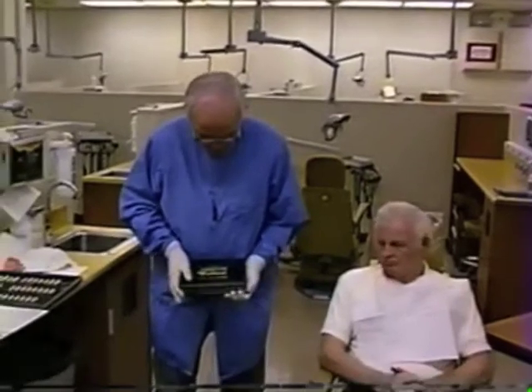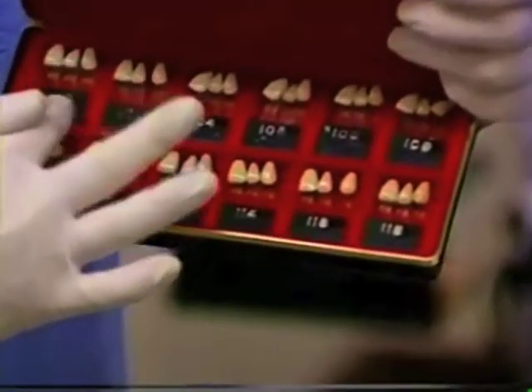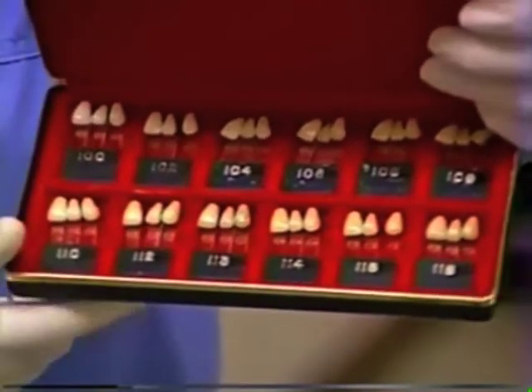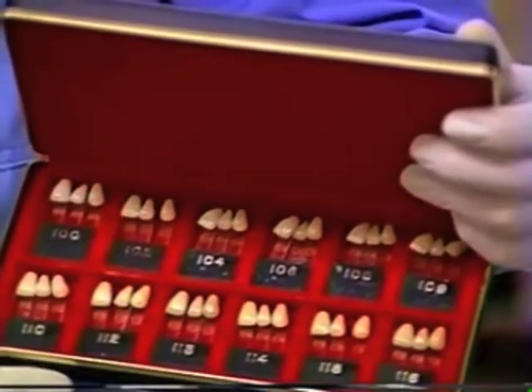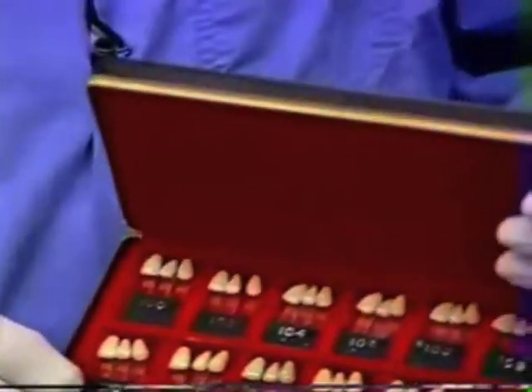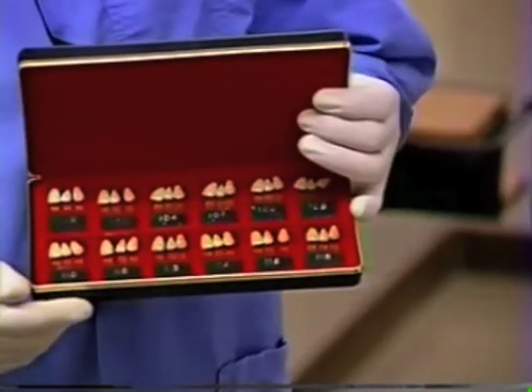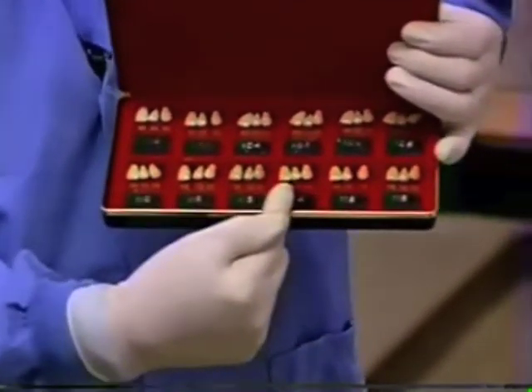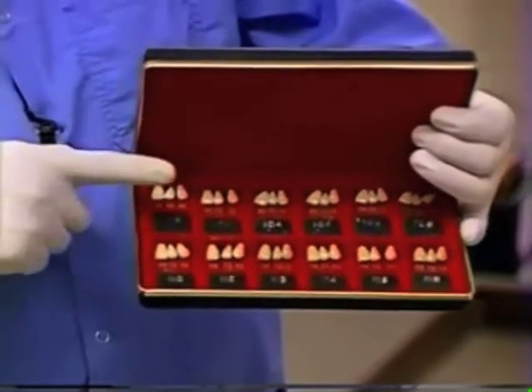The next thing is to select a color or shade of tooth from the shade guide furnished by the manufacturer. They generally come in six different shades. The top row — shades 100, 102, and others — are fairly nondescript teeth that vary in color but aren't highly characterized. The bottom row of teeth have little check marks and stained spots built in that make them look quite aged, suitable for a masculine patient where you'd want to add characterization.